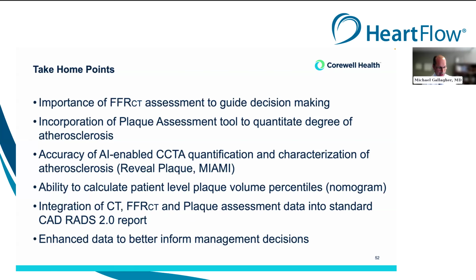We talked about incorporation of plaque assessment tools to quantitate the degree of atherosclerosis. We really verified some of the data from Reveal Plaque in Miami about the accuracy of quantification. And we are able to calculate a patient-level plaque volume, integrate all that data into a report, and we can use that data to better inform our management decisions.